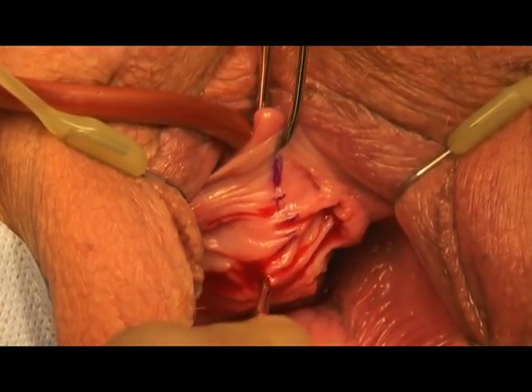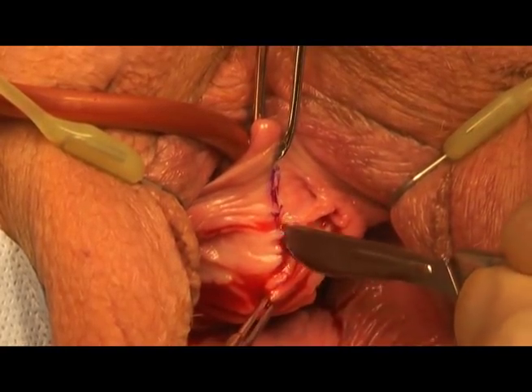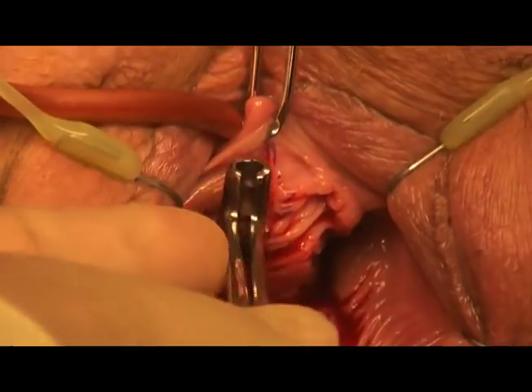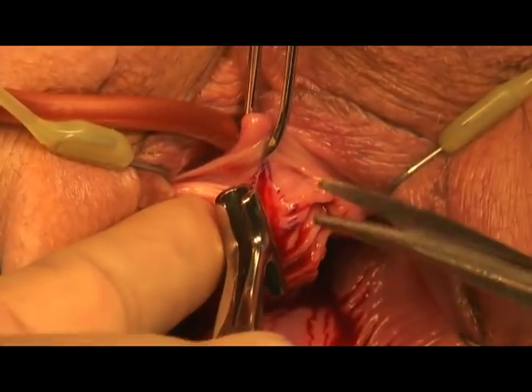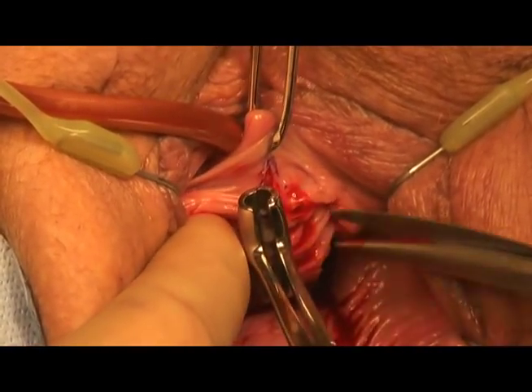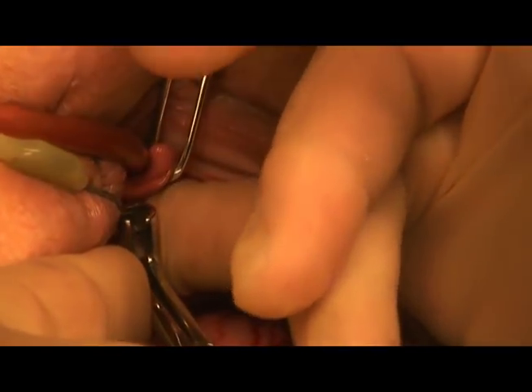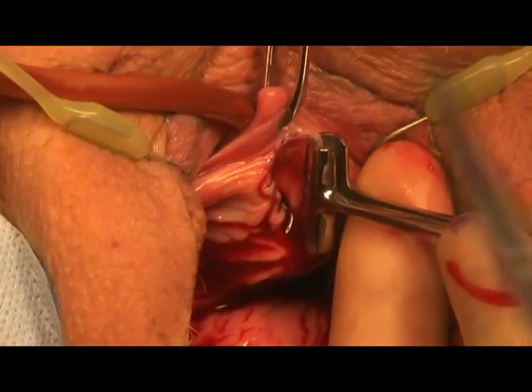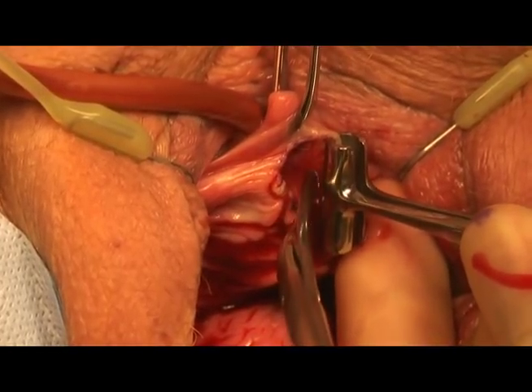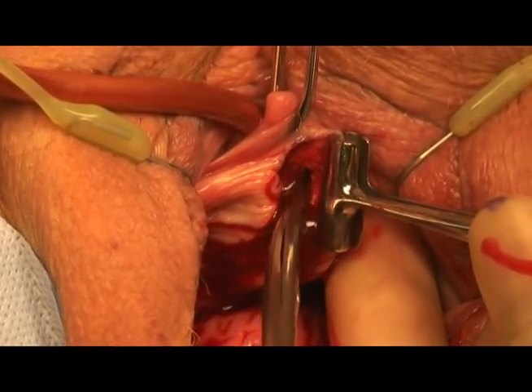Next we do a mid-urethral incision. It's about a centimeter and a half because the mesh itself is 1.1 centimeters. If needed you can do a two-centimeter incision straight down vertically. Once I've made my incision I'll grasp the edges with a T-clamp. Then I use my Metzenbaum scissors to dissect and reach right beneath the pubic ramus on the patient's left side. I then put my smallest finger to see if I can reach the bottom edge of the pubic ramus.